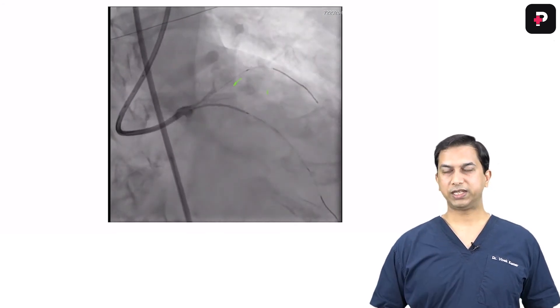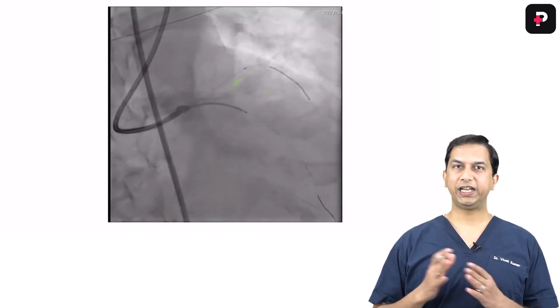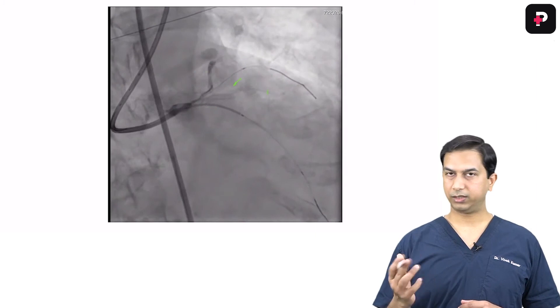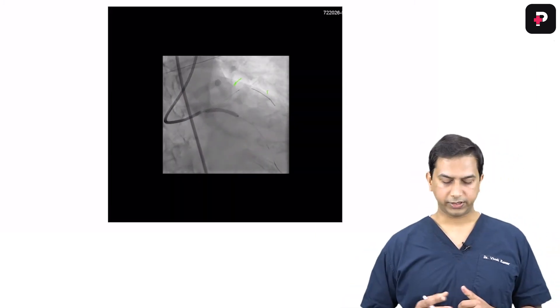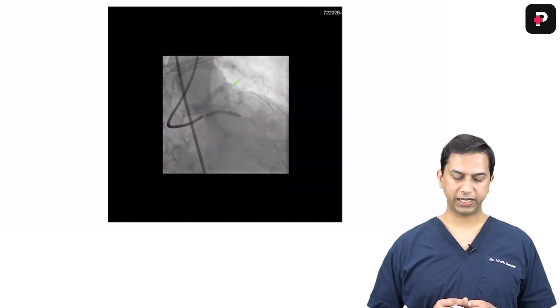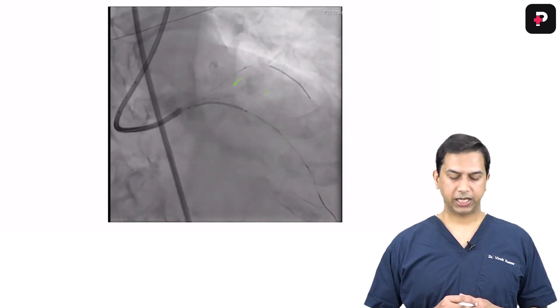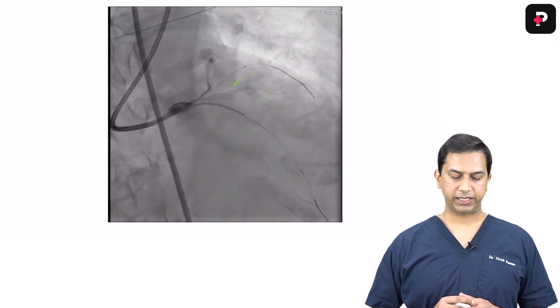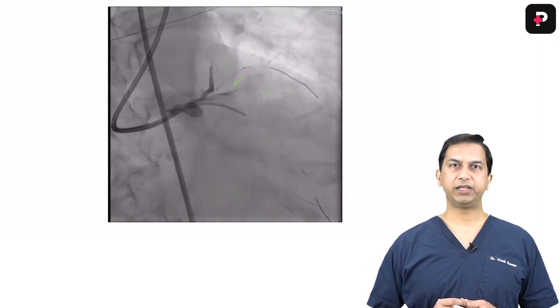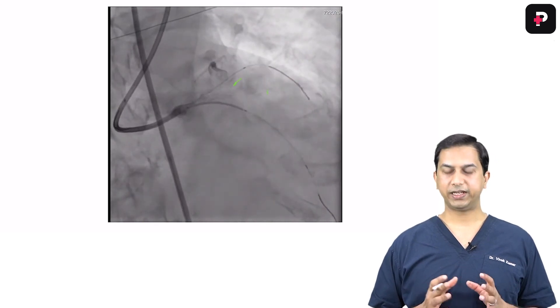This was effectively a triple bifurcation — diagonal-diagonal bifurcation, LAD-diagonal bifurcation, and distal left main bifurcation. There should be sufficient length of struts in the proximal main branch so that you can effectively crush that stent with the other stent. Now that the side branch stent has been deployed, you optimize the positioning of the left main-to-LAD stent. To best visualize the ostia of the left main, the best view is either LAO cranial or RAO cranial — whichever best shows the anatomy.